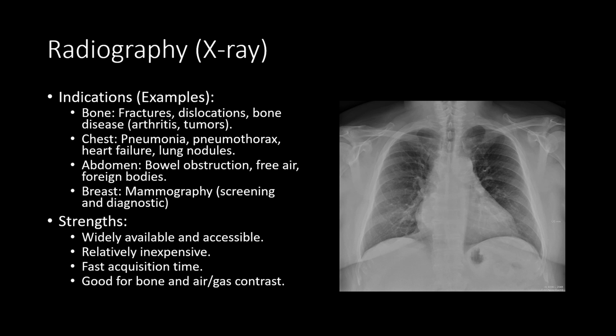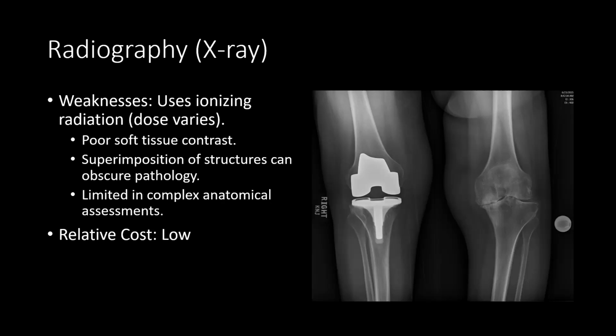The strengths of radiographs are that they're widely available, very accessible, and in many indications can be read by the person ordering the study, or at least previewed by the person ordering the study. They are relatively inexpensive, they're very quick to take, and in general, they give you really nice contrast between bone and gas and soft tissue. But because they are a 2D modality, they are somewhat limited.